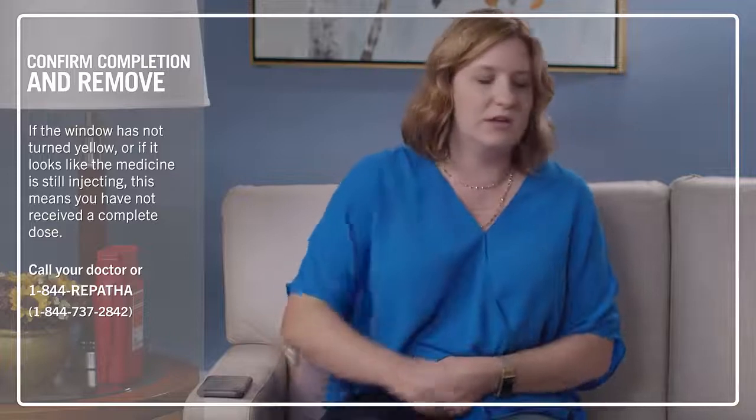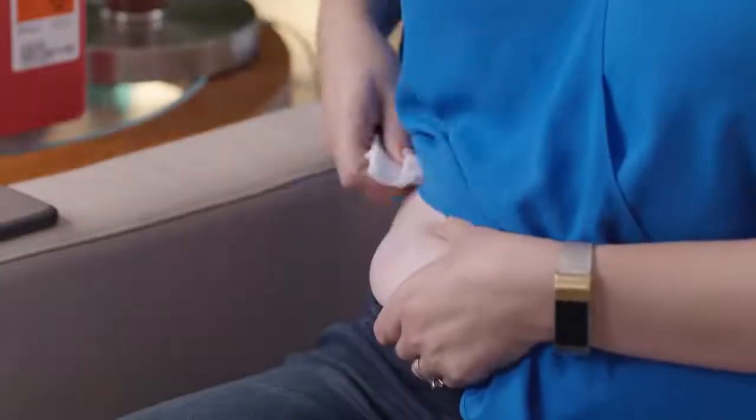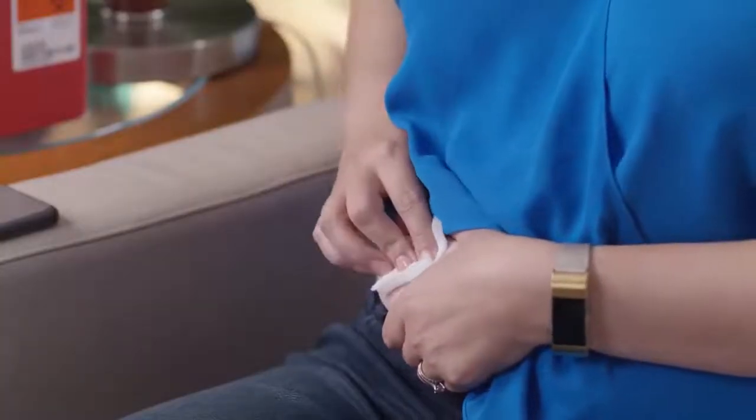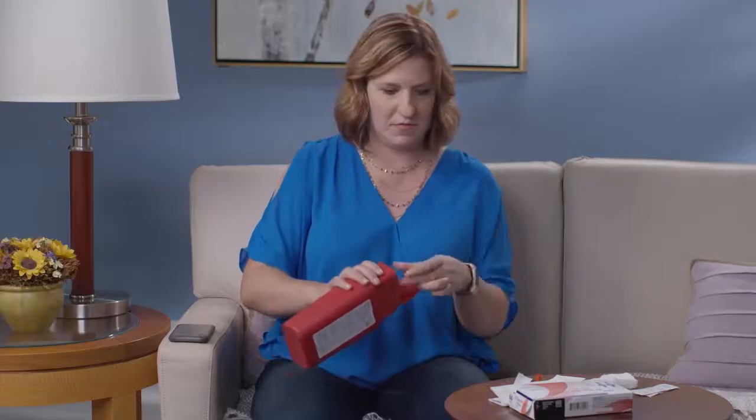If you see a drop of blood, you can use the gauze or a cotton ball — press it on your skin. You can use a bandage if you want. Then it's time to discard the auto-injector. Place it in the sharps container, along with the orange cap. And that's it — you're all done.